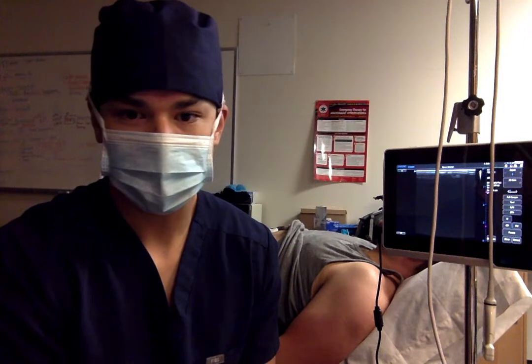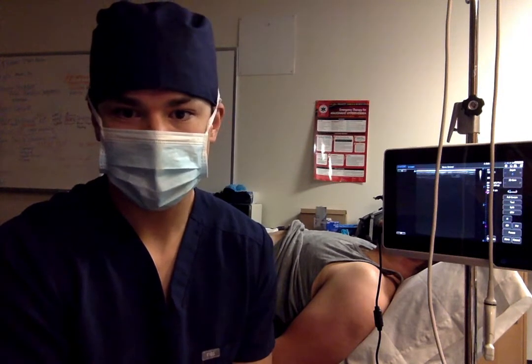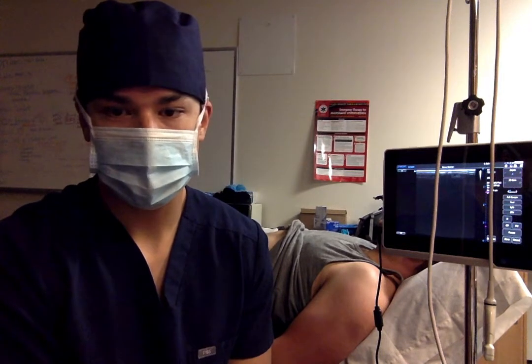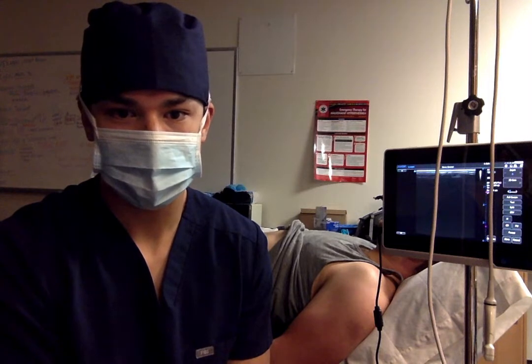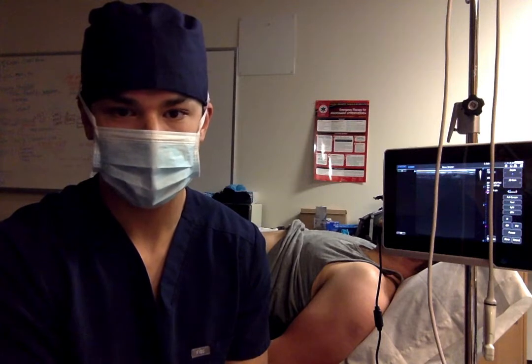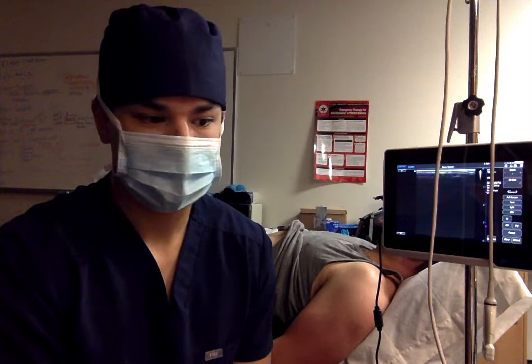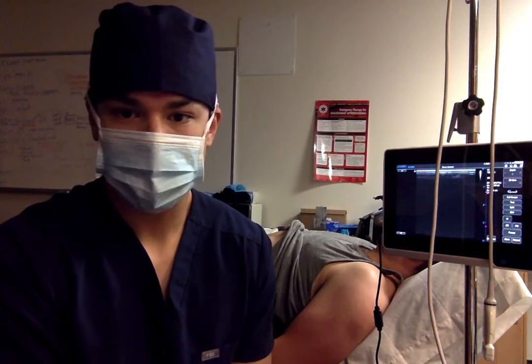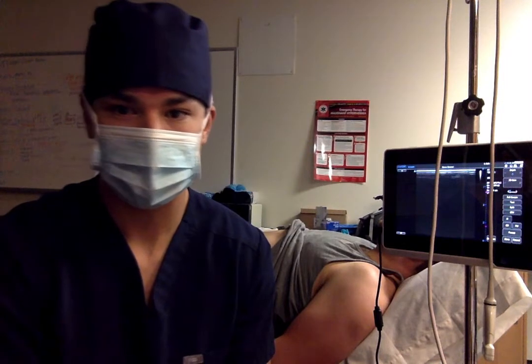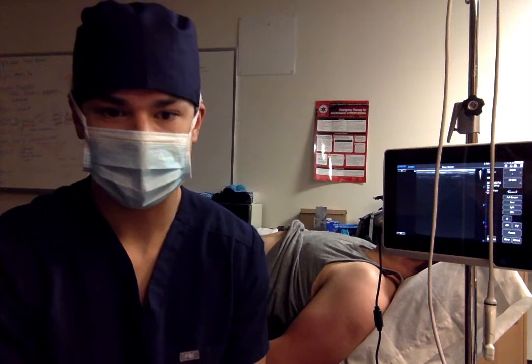Some risks of this would be a punctured bowel or peritoneum, bleeding, and infection. This is going to allow us to reduce the amount of pain meds we have to give during surgery and after. It's going to reduce your pain post-operatively, and we can do this under general anesthesia, so you won't even know we're doing this. If you don't want this, then it will just increase the amount of pain meds we have to give to you post-operatively, and that comes with side effects of opioids such as nausea, vomiting, and constipation.